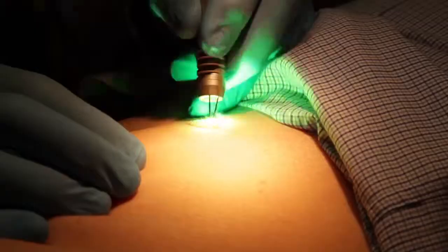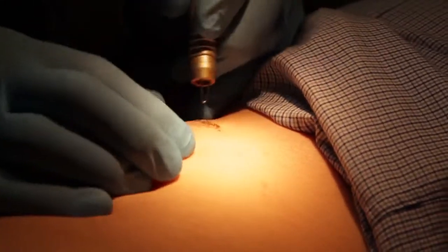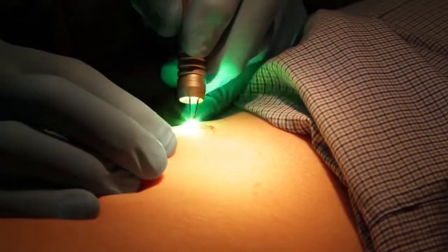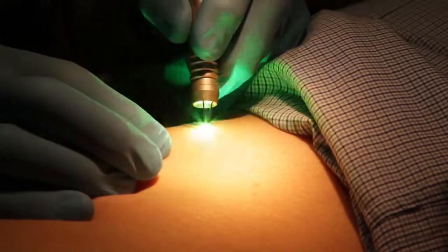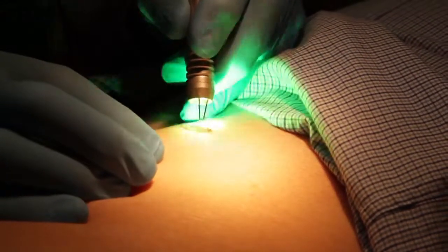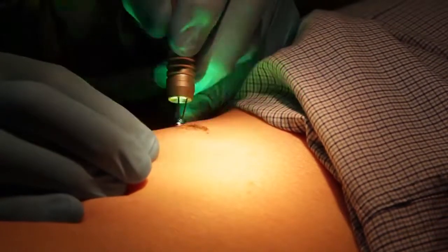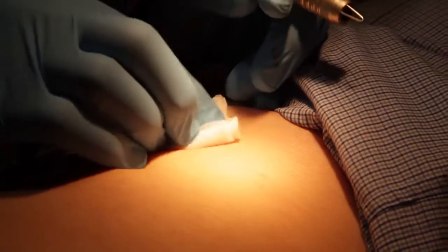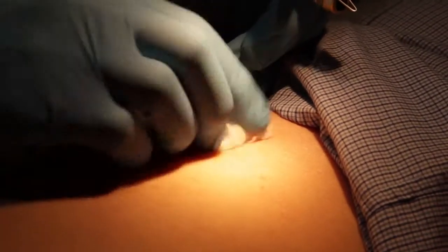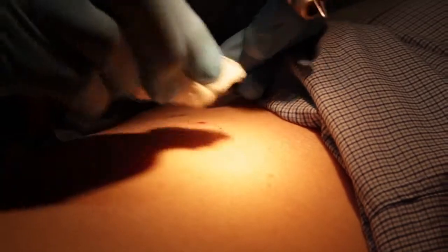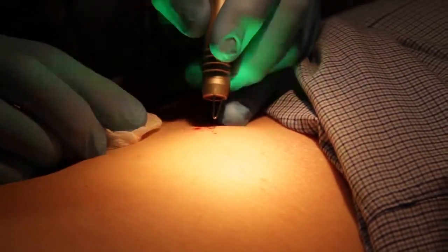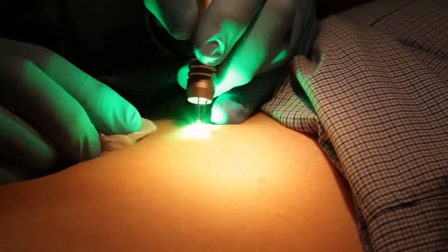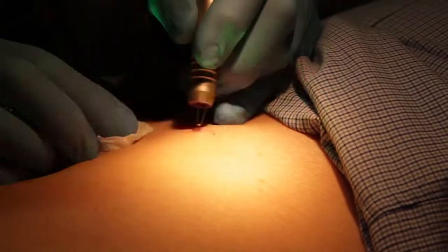When we're lasering bulky lesions such as thick seborrheic keratoses we're able to coagulate the tissue and as you run over the lesion with the laser backwards and forwards you can see it coagulating and going whitish and that softens the tissue and you can actually wipe it off. Then that takes off the top layer and there's often a little layer left behind which you just finish off with another pass.